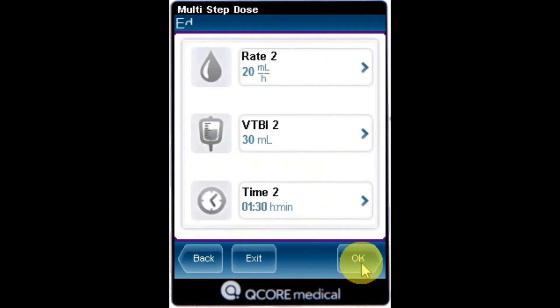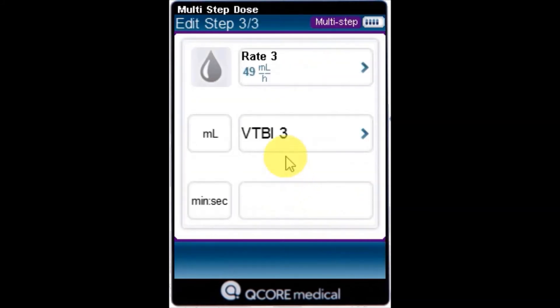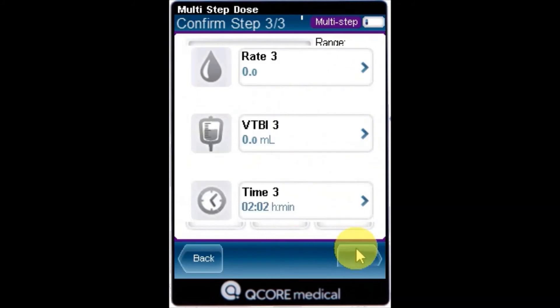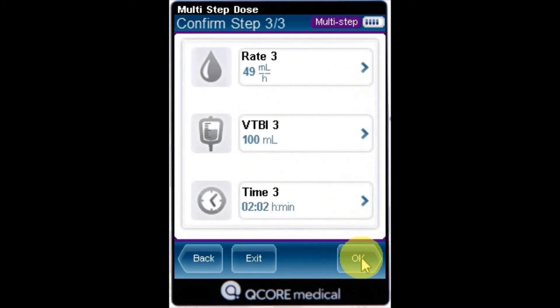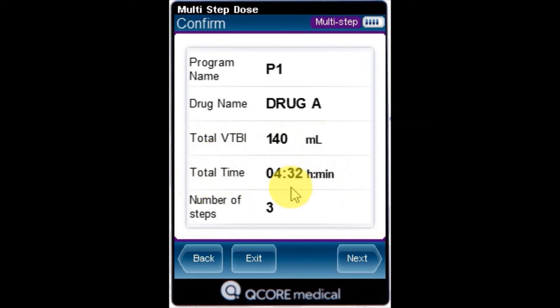After the final step is programmed, the confirmation screen appears, displaying the following parameters: Total VTBI — the amount of fluid to be delivered during the entire infusion; Total Time — the time period of the entire infusion; and the number of steps making up the total infusion.